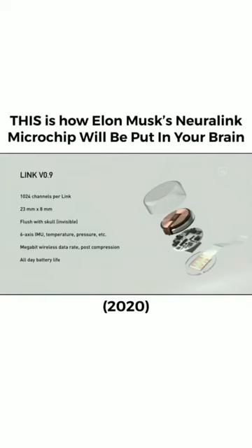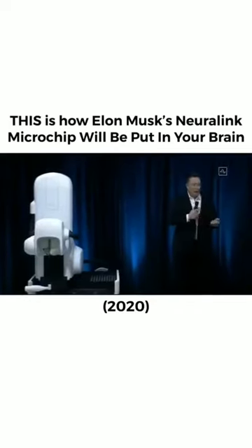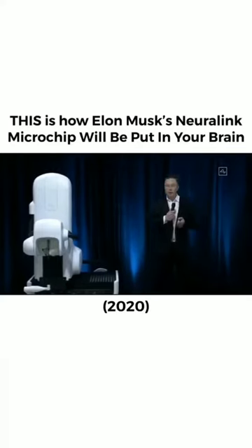And it's 23 millimeters by 8 millimeters. It actually fits quite nicely in your skull, because your skull is about 10 millimeters thick. So it goes flush with your skull, it's invisible, and all you can see afterwards is this tiny scar. And if it's under your hair, you can't see it at all. In fact, I could have a Neuralink right now, and you wouldn't know. Maybe I do.